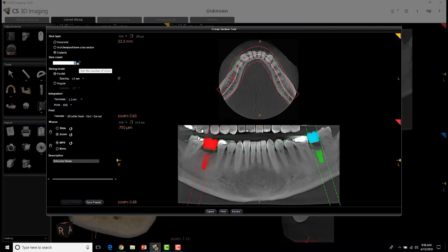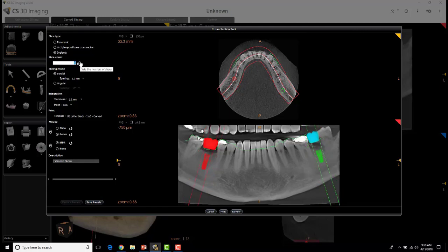This is actually going to give you nine slices per implant with one millimeter cuts. If you wanted more per implant, you can just highlight and select 15, or whichever number you want. You'll notice that the distance of each of these areas automatically increases. You can change this back to nine and you'll see the views get more narrowed again.